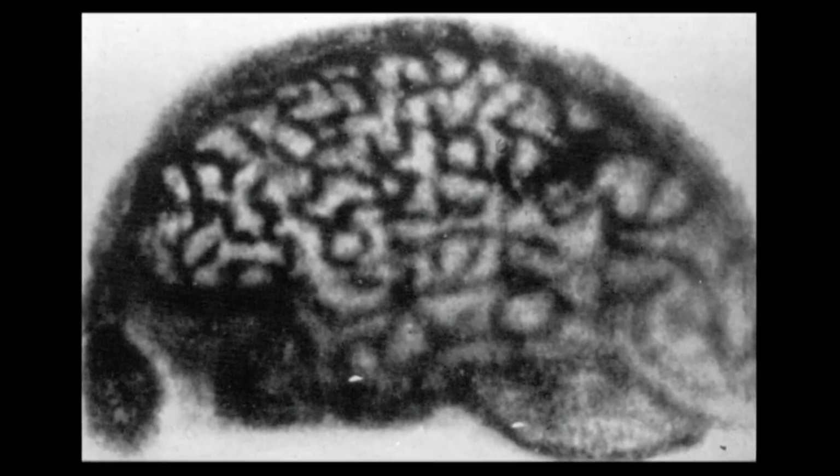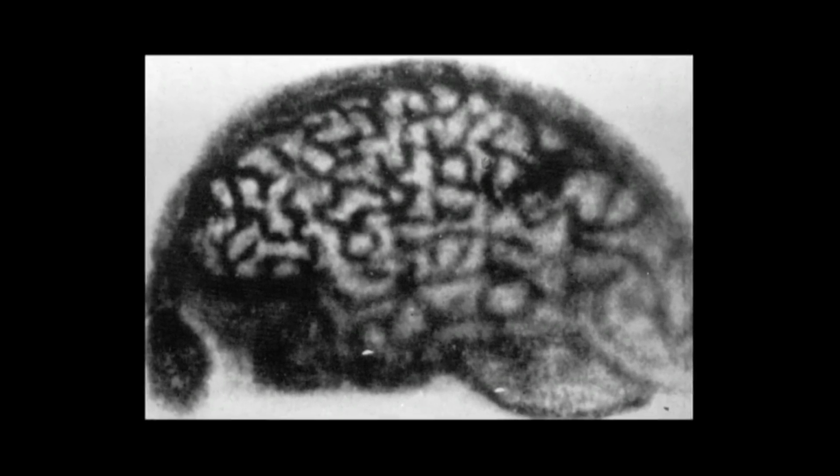This image, reported in the popular press near the end of the 19th century as the first X-ray picture of the living brain, was eventually debunked as a clever fraud, actually representing cat intestines filled with a mercury compound and radiographed in a brain-shaped pan. In the early 1900s, the great scientist and inventor, Thomas Edison, announced his intentions to be the first to radiograph the brain.